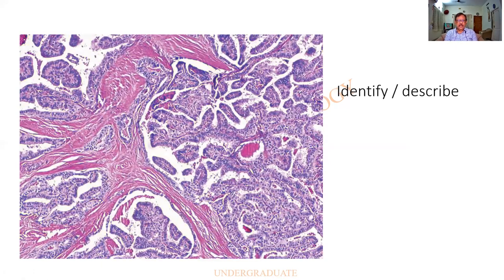And how can we describe such a thing? Usually the students have got a lot of difficulties. Two components I am seeing. All this is tumor. The bluish ones mean more nuclei, so tumor. And the pinkish one is fibrocollagenous septae or bundle. So this is a tumor. And I find that it has got a projection, a finger-like projection. And here, sometimes you find that they are branching, they are anastomosing, joining together. So this is a typical picture of a thyroid tumor.